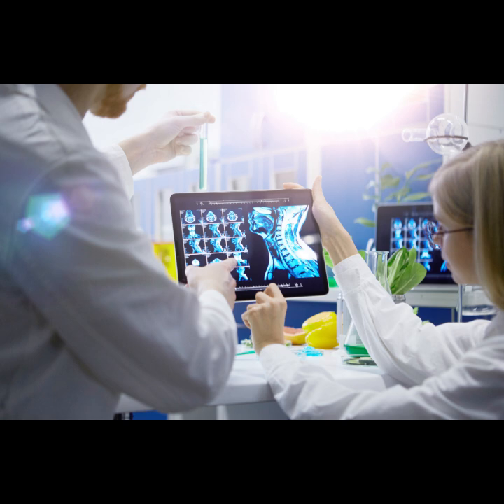Signal disappears quickly. A gradient echo sequence tries to recover some signal by reversing the gradient polarity. So you fly out in K-space using a positive gradient, then you switch to a negative gradient to fly back towards the center. Yep, the negative gradient reverses the phase shifts caused by the positive gradient, causing the spins to rephase and form an echo signal peak when you get back near the center. It's like rewinding the effect of the applied gradient.